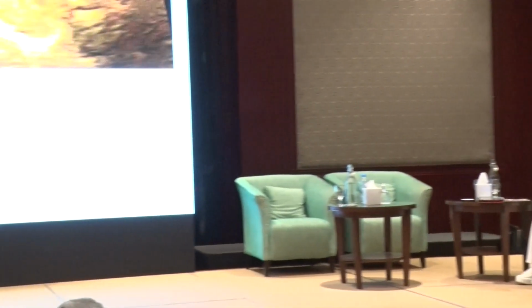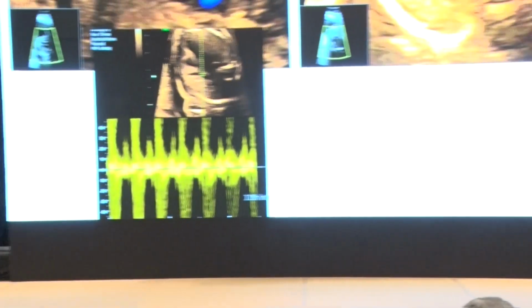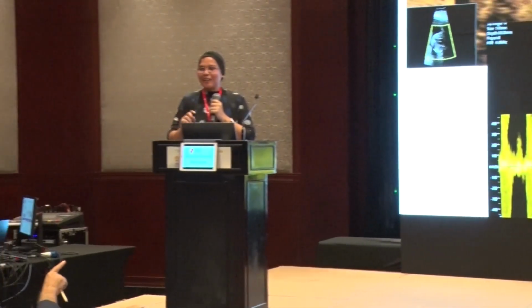So this patient is delivered already, I assume? Delivered or not yet? No, she's 21 weeks. This week we scanned her. Okay. So it's still a puzzle. Actually, one of the pictures you showed me almost convinced me.